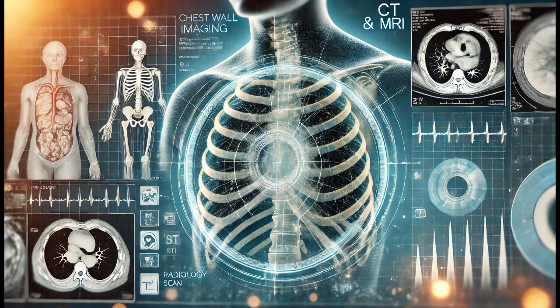Precisely. And the really cool thing is that we can take images from different planes. We can look at the chest wall from the front, from the side, even from above. And we can put all of those images together to get a really comprehensive view. We call that multiplanar imaging. Oh, wow. Like a 3D puzzle, but with your insides. Yeah, exactly. And that helps us make more accurate diagnoses and plan treatments more effectively.